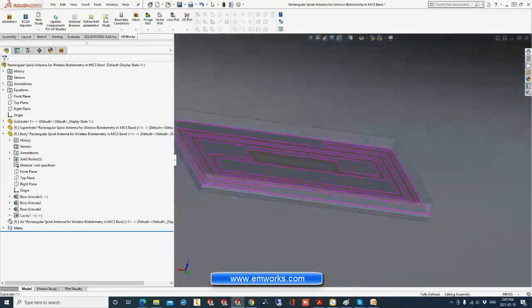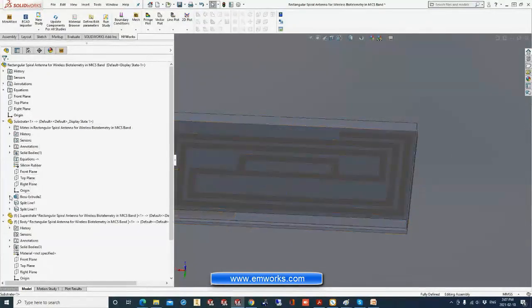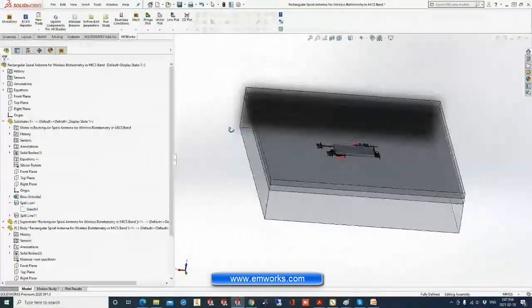And the antenna, as you can see, has some dimensions that we created here. And it's very useful to use smart dimensions. Why? Later we will be able to drive any dimension, to change any dimension within the same geometry. It means no need to work with another assembly. We can take the same assembly and play with the geometry, simulate different scenarios, and compare the results to see the impact of any parameter on our output. So this is the model.